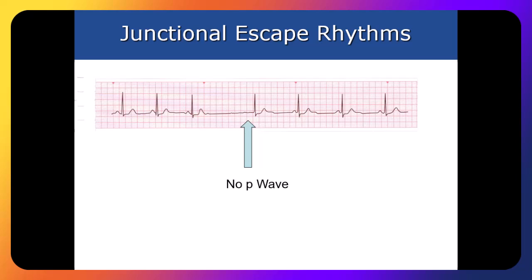Now, remember, simply because you see this on your EKG does not necessarily mean that you've got mechanical action. The only way you can do that is by assessing your patient, watching your monitor, and you would feel that beep, beep, beep. And often that R to R interval right after the escape beat will be a little bit shorter than your normal R to R intervals.